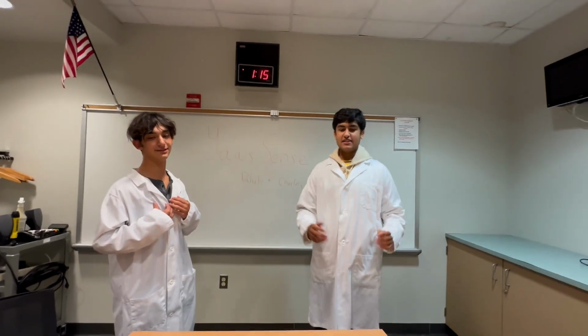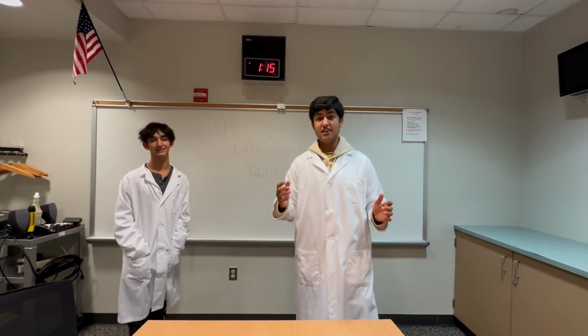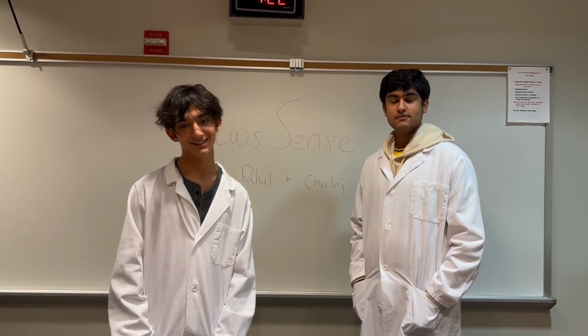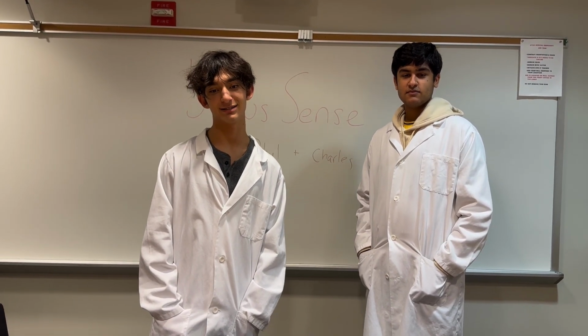And I'm Charlie Ayrton. Today, we are here to present to you YawsSense, a novel device to detect yaws. Yaws is a chronic bacterial disease that affects the skin. It is caused by the bacteria T. pallidum subspecies pertenue. It is closely related to the syphilis disease.